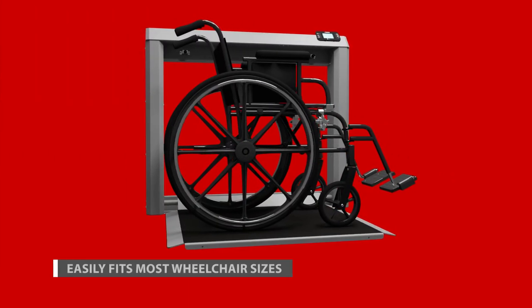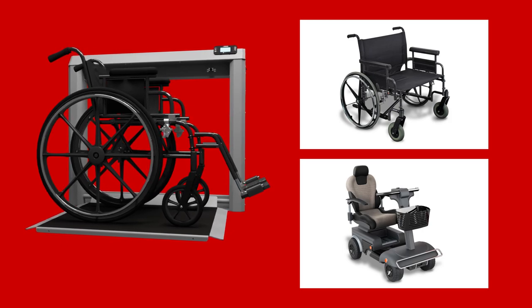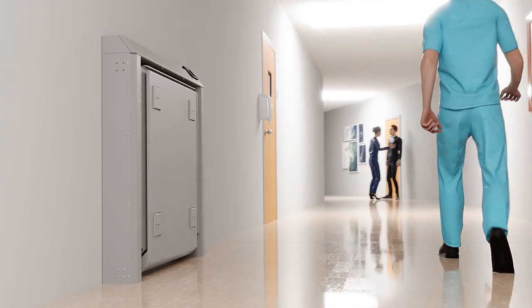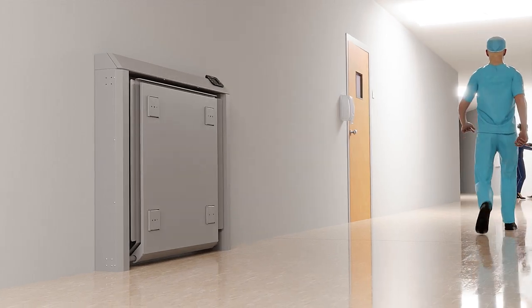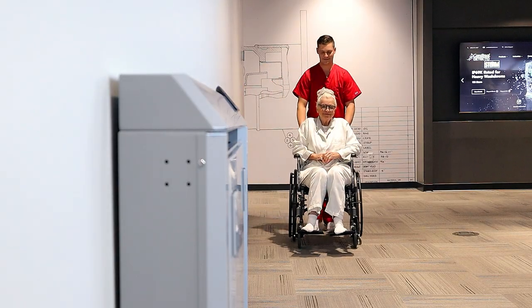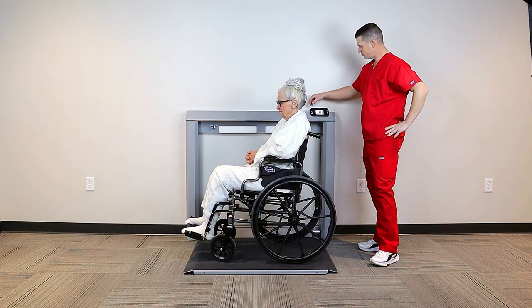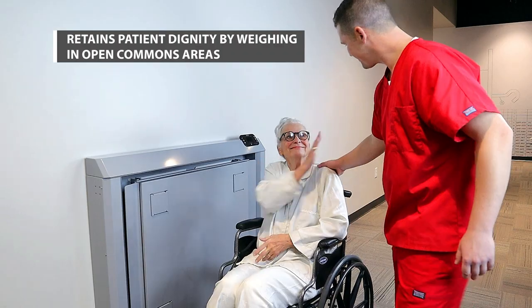The 7550 easily accommodates most wheelchair sizes, including most power wheelchairs. The slim 7-inch (18 centimeter) profile takes up minimal space when installed in a medical facility hallway, clinical office, or patient room. This method of care retains patient dignity by weighing in open commons areas instead of back rooms or closets.